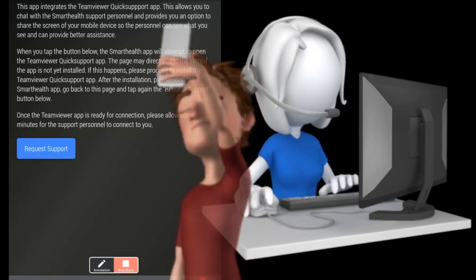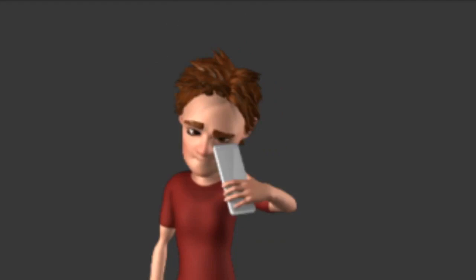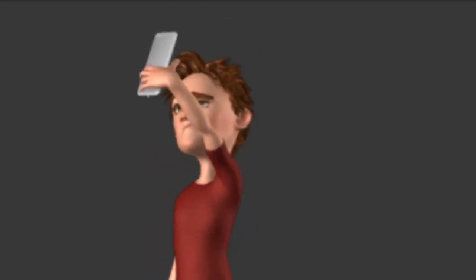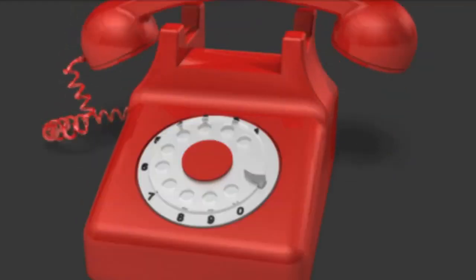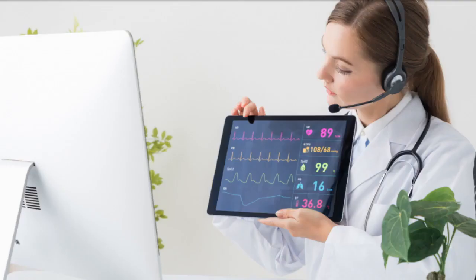It isn't necessary for the user to find these special features on their own. Included with each sale of Smart Health One-on-One home monitoring equipment is our welcome call to the user confirming that the product was delivered and helping the user with any questions. We will assist them through their first test and verify that the test results uploaded correctly.